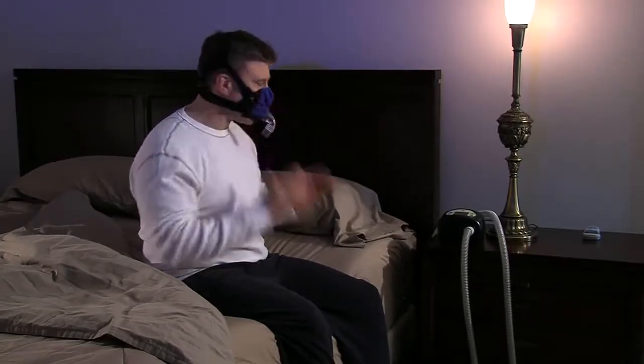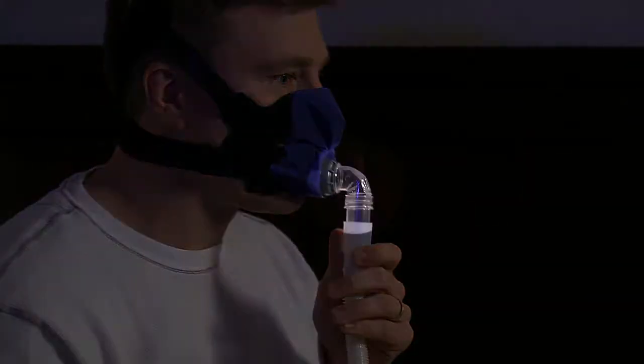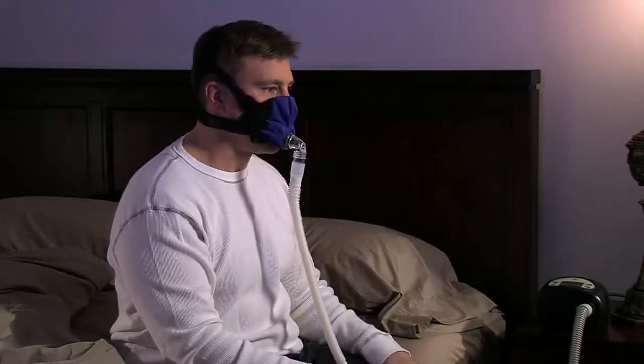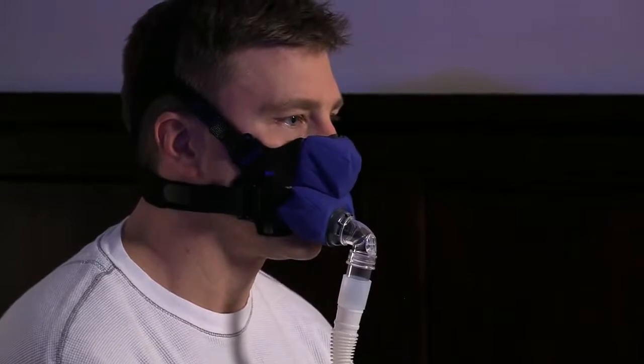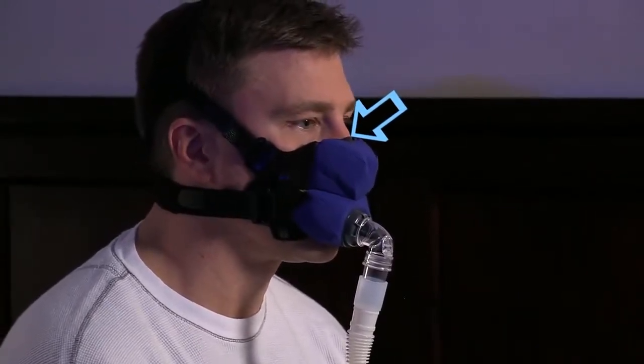Attach the mask end of your optional SleepWeaver featherweight tube or connect your 6-foot PAP tube directly to the 90-degree elbow. Make sure that the other end of your hose is securely attached to your PAP machine. Turn on your machine. Both mask sections will inflate like a balloon to create the seal. A small amount of black fabric will show on the bridge of your nose when the mask is in use.